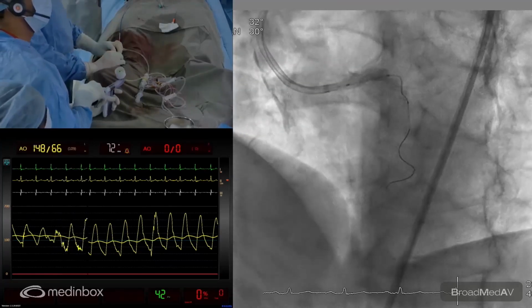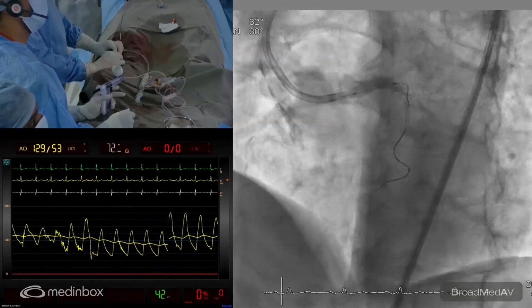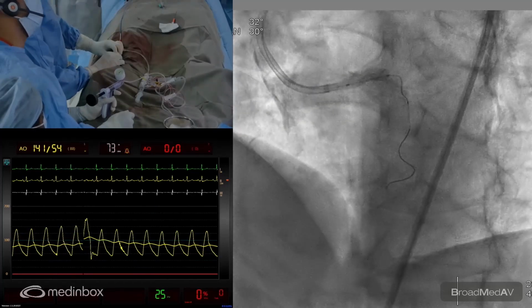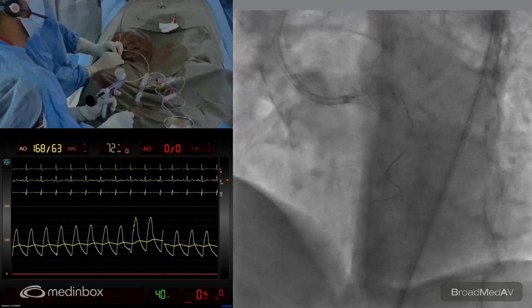12. Deflate. Deflate. So I think the stent moved a little back during the inflation into the left main ostium. The stent did move a bit, but I think that's expected because I was pushing the balloon. But there's no disease at the bifurcation, so it's okay.